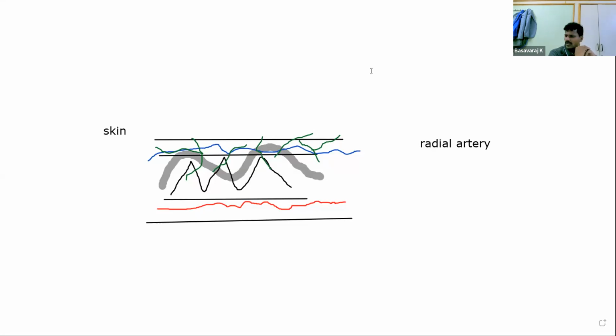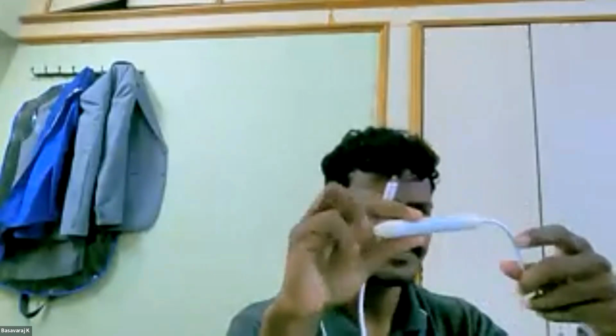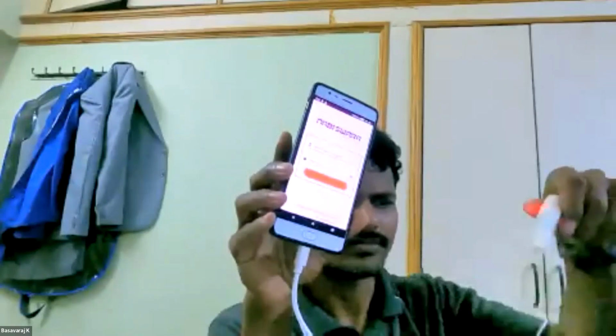So can you look at the device? Definitely, I will show you. I will even show you how to take the pulse report and all. So this is the device. Here is the sensor. You connect this to the mobile like this. The device will turn on automatically.